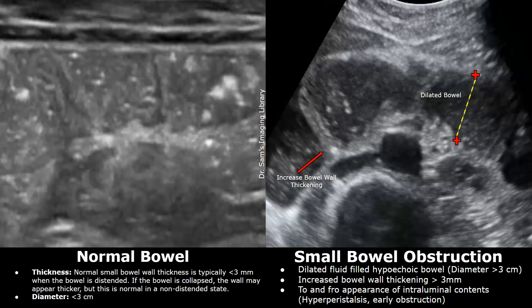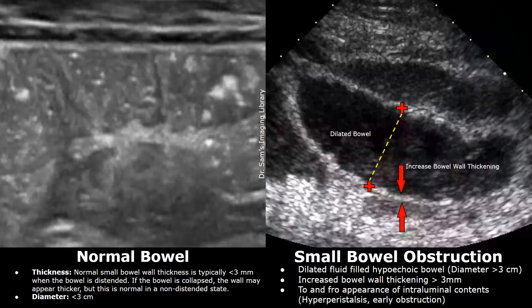Here is another case of small bowel obstruction with a diameter greater than three centimeters. Bowel wall thickening was greater than three millimeters — increased bowel wall thickening can also be seen in some cases. There was a to-and-fro appearance on real-time imaging indicating hyperperistalsis. This is another case with dilated hypoechoic fluid-filled bowel loops, wall thickening greater than three millimeters, and hyperperistalsis indicating early obstruction.